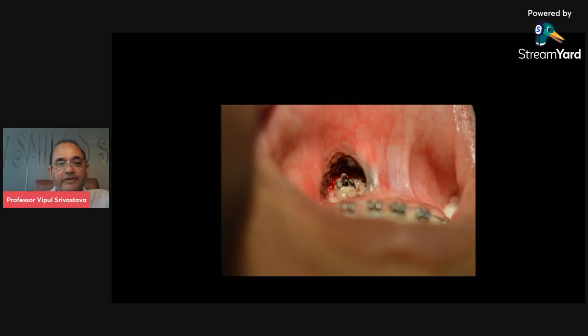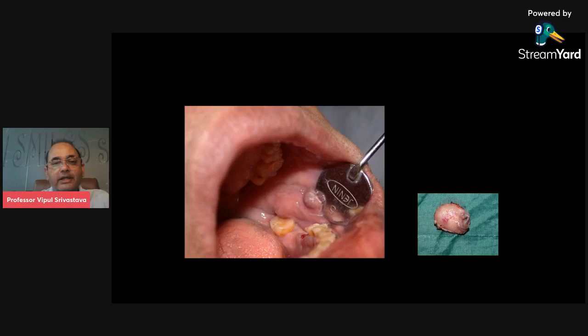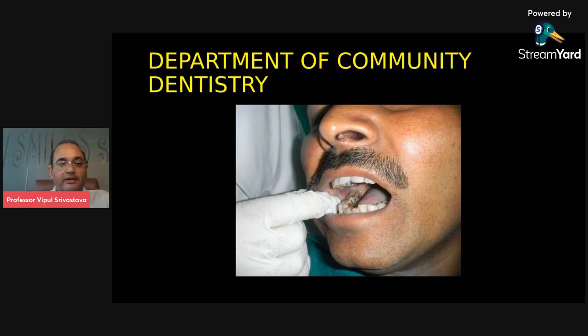Laser in oral pathology also, we would like to mention. I can always take a specimen of a growth or tissue and send it to the lab for diagnosis. We have done a couple of cases. The only important point to mention here is to let them interpret it away from the excision site. Wherever there is laser excision, there may be some amount of charring, loss of blood and necrosis. So let them interpret it so that we don't get any confusing interpretation or result. So this is something about laser in oral pathology.